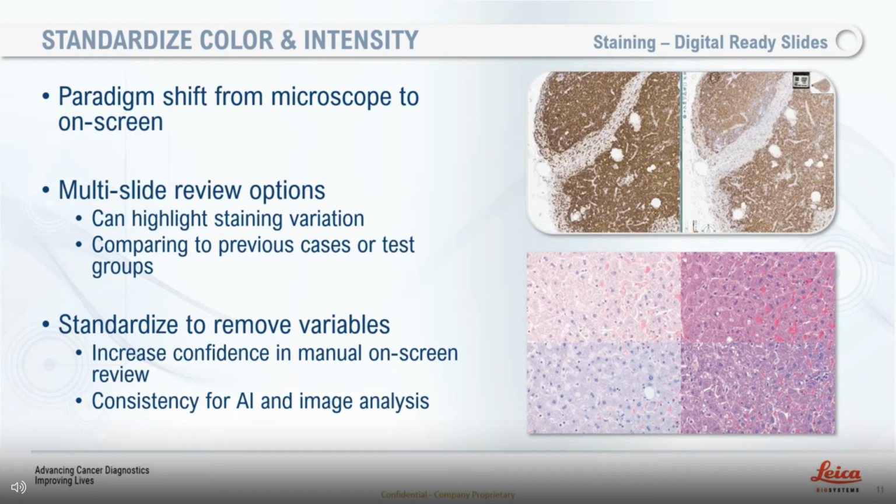It also potentially has that impact as you start looking at AI development and what's the variability in your input to those training sets, and what impact does it actually have then on the size of the training set that you need and the performance of your AI tools.